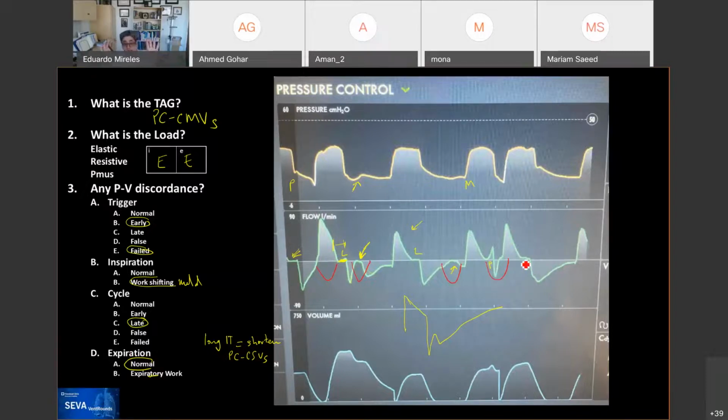So this patient was very desynchronous with the ventilator. The question that I had for the team when I came to the bedside was, have you tried pressure control or pressure support for the patient?